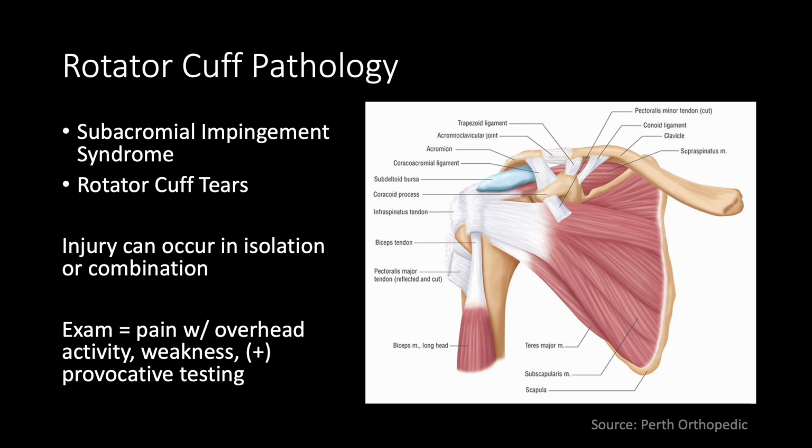Reviewing our anatomy, the rotator cuff involves 4 muscles that originate on the scapula and insert on the glenohumeral joint capsule. The supraspinatus arises along the superior portion of the scapula, above the scapular spine, and courses superiorly under the acromion to attach on the greater tubercle. Due to its direct path between 2 bony surfaces and its importance to abduction and shoulder stabilization, this tendon is the most commonly injured structure of the rotator cuff.